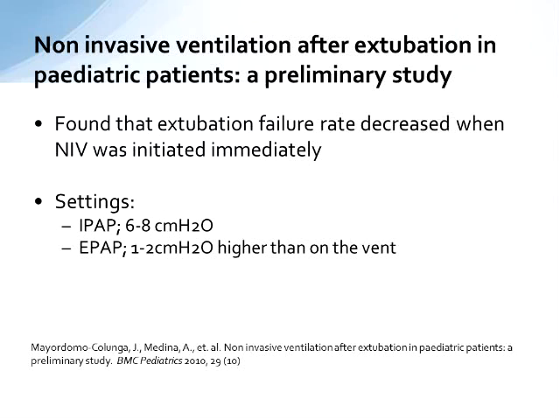And they reevaluated those children over 48 hours and over 12 hours. And what they found was those kiddos that were placed on non-invasive ventilation immediately after extubation did better than those that were placed on as a rescue means, so when they started to fail. And these are the settings that they chose to use as sort of the proactive, immediate extubation approach, and were pretty successful with that technique.